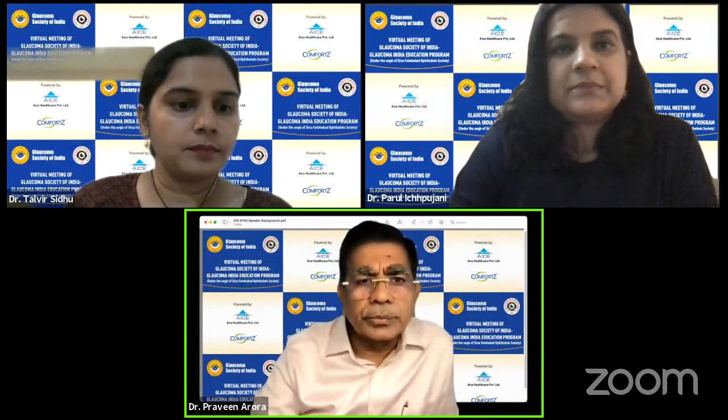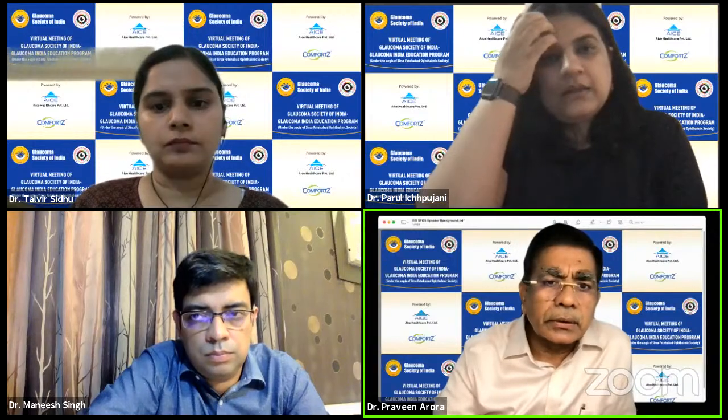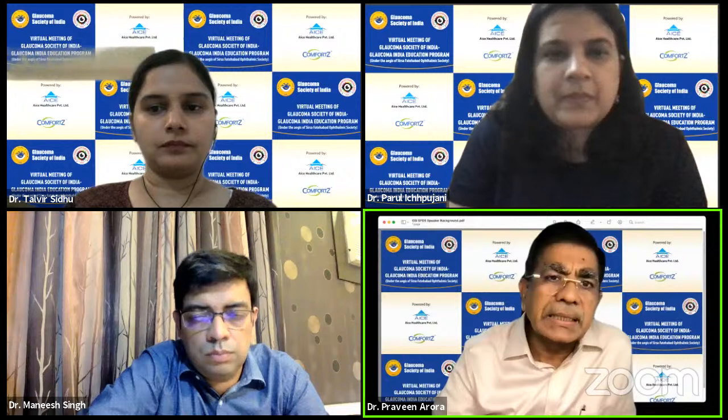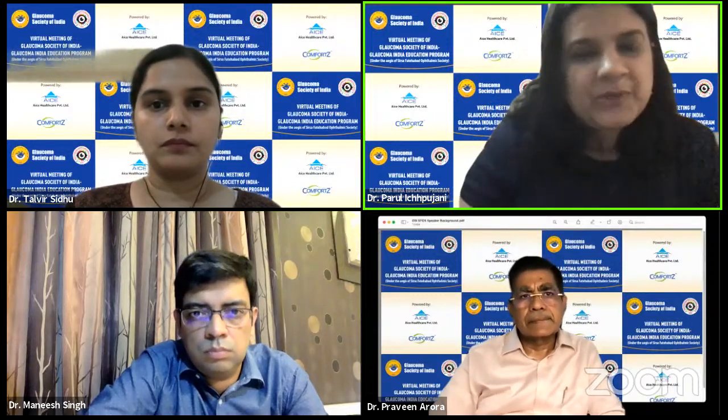I have one comment to make: for optic disc sizing, OCT is also a very good tool, because OCT reports mention the size of the optic disc, which clinically may not be easy to measure. In some cases, sir, it is a good tool, but in cases where there is a tilt, and for every patient anyway, you need not get an OCT done in the very first go when it can be done manually.